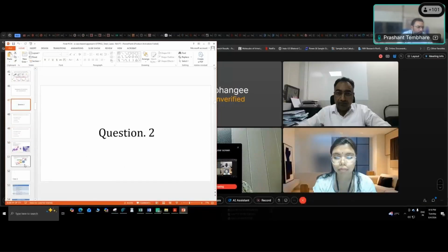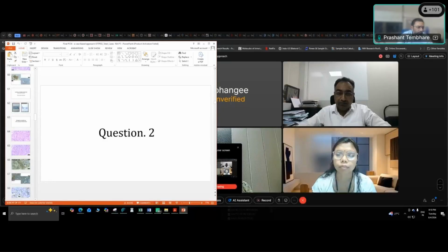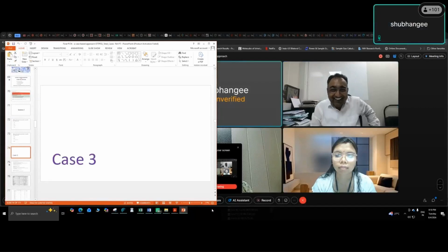Let's move to case 3. Now you have all your slides here. Sir, here's one question in the chat box. Can I? Yeah.